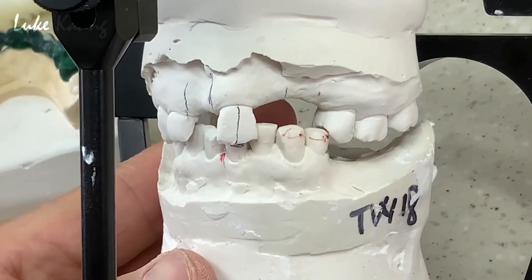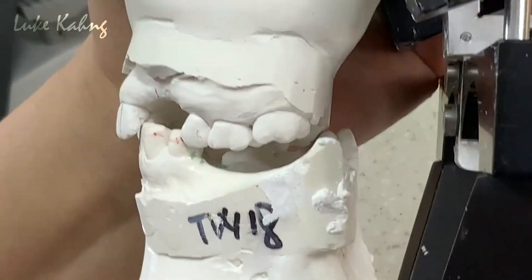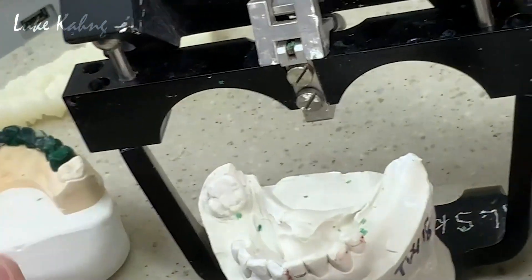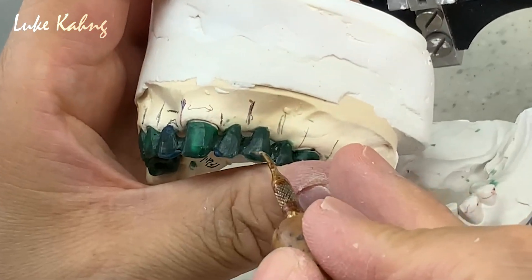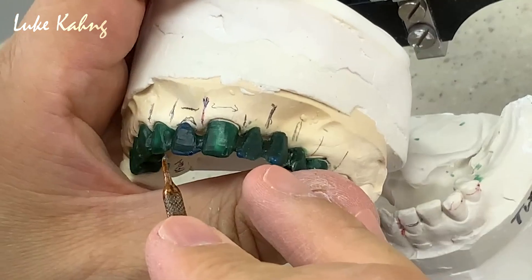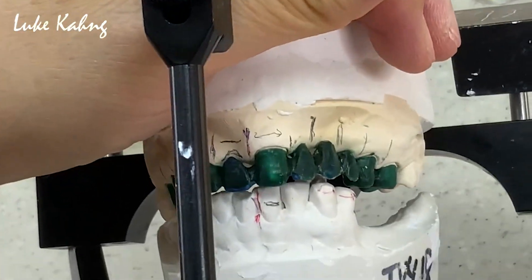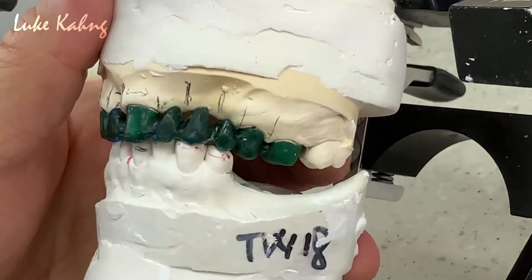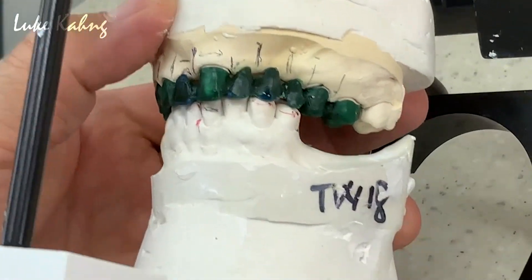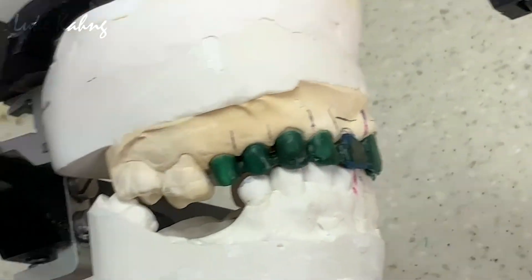Remember, I have to make this better. You see the canine-premolar in side view — slightly longer here, and here too, then good to go. We can do casting.